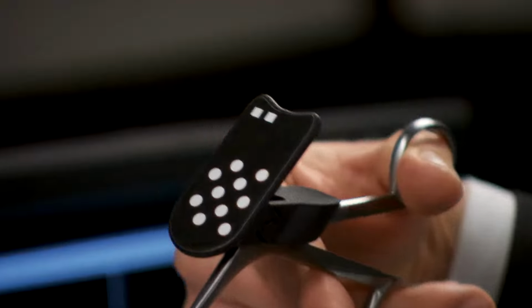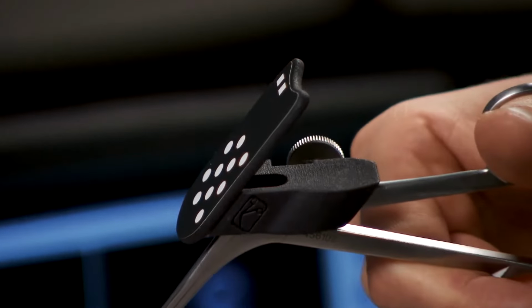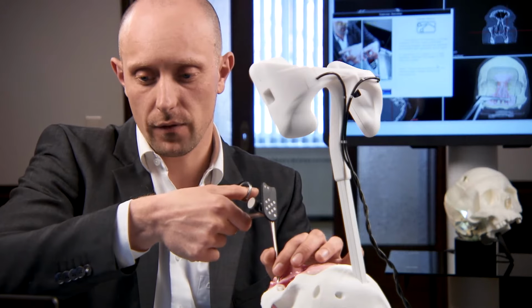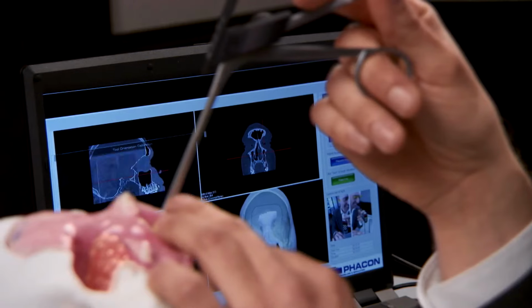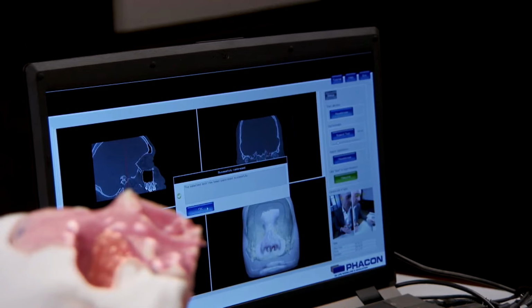Angle number 1, angle number 2, number 3, number 4 and number 5. In the last step, please hold the instrument perpendicular to the skull, okay? And the instrument is calibrated. So now we have finished the important steps. You can operate now directly on the patient.